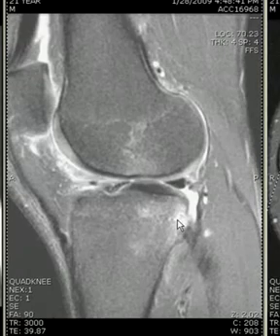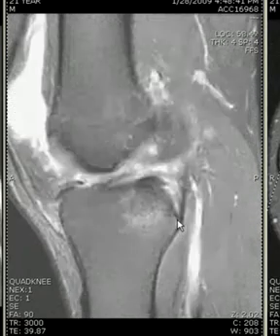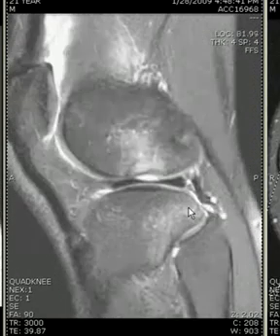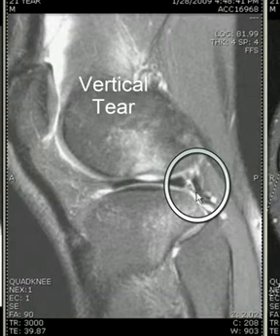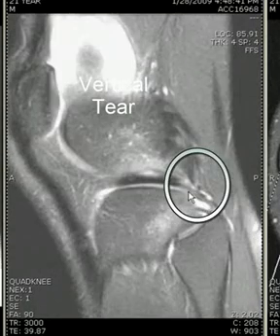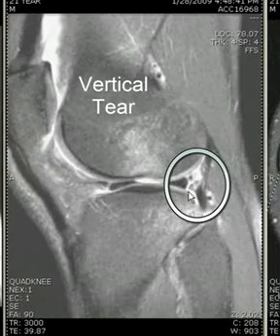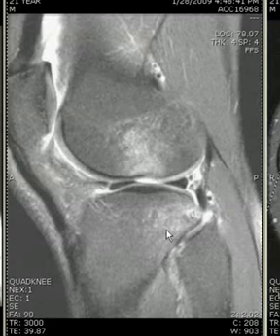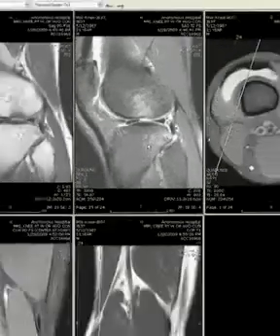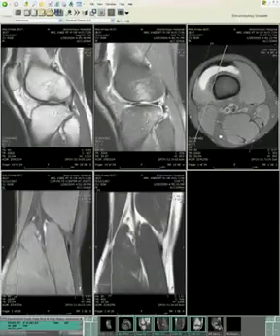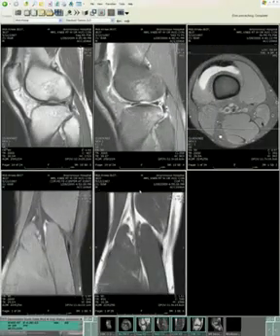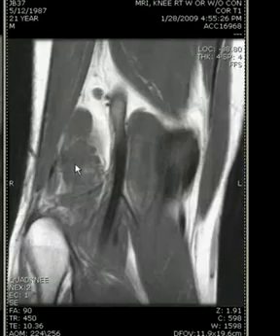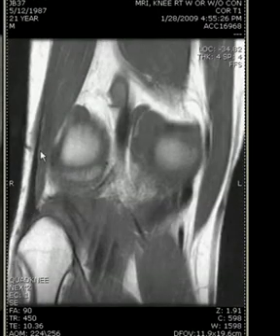These vertical longitudinal tears are highly associated with anterior cruciate tears but can be easy to miss, because one can assume that's just fluid around the popliteus tendon. As you can see here, this is not around the popliteus tendon but is a vertically oriented tear in the peripheral red zone.